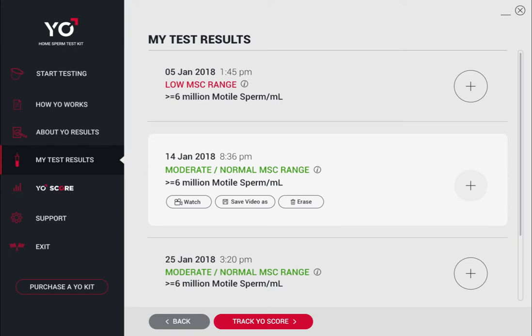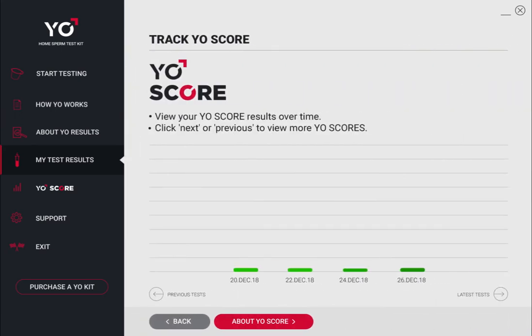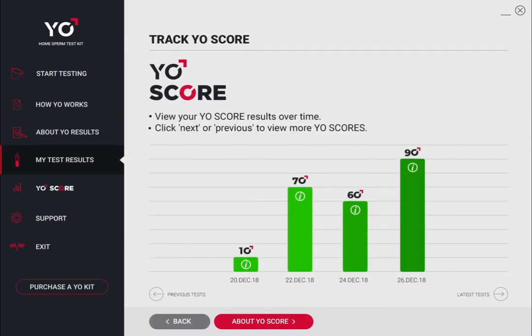View your test results in the Yo archive where you can watch, save, or delete your video. Click Track Yo Score to see how your Yo score compares to thousands of other men. Track your Yo score over time to gauge the results of lifestyle changes you've made.